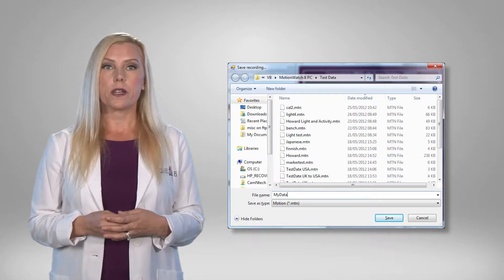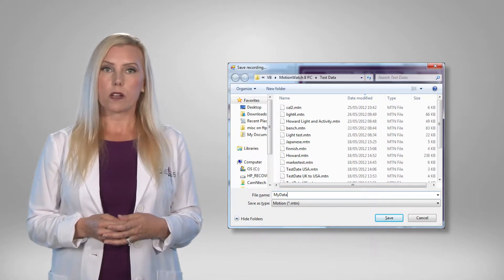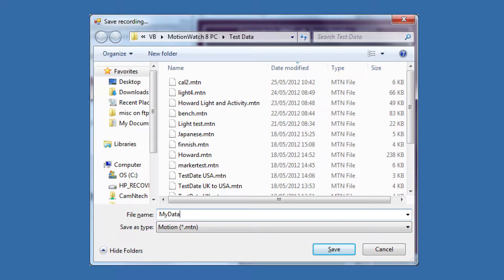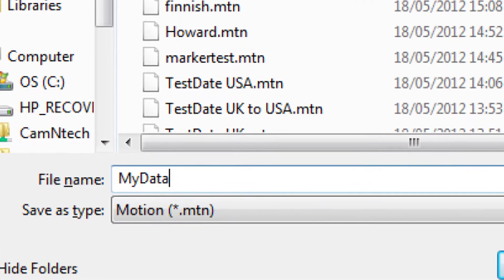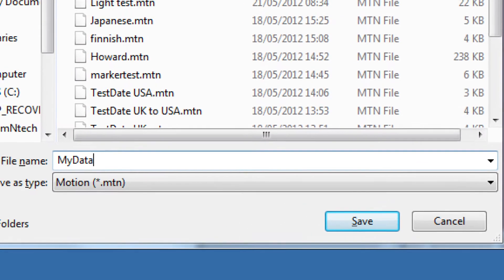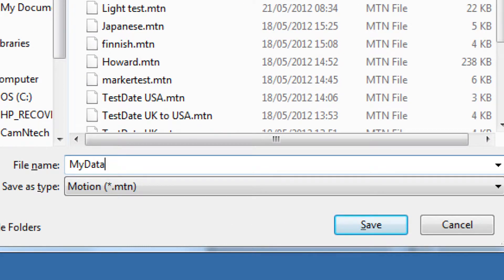Upon completion of the download, the Save Recording dialog will open automatically to allow the data to be saved. This window allows the destination for the file saved to be specified. Type the name of the file as required and click the Save button. The file will be saved in the default .mtn format.